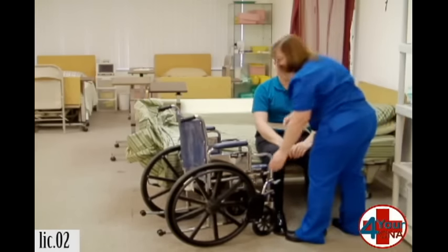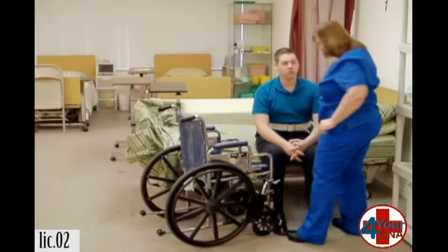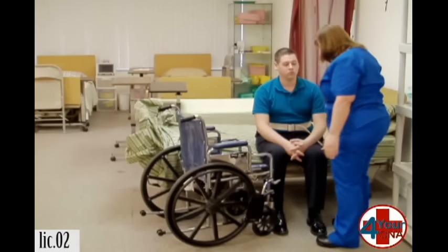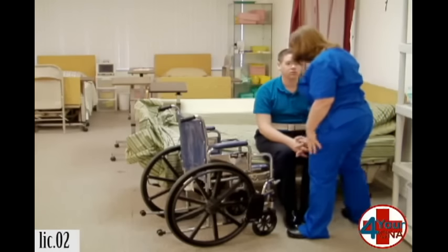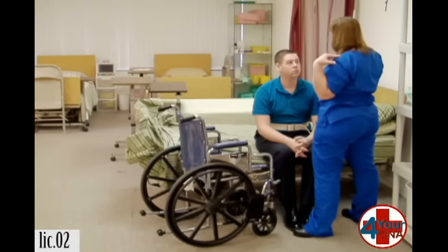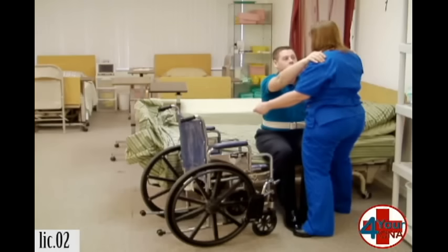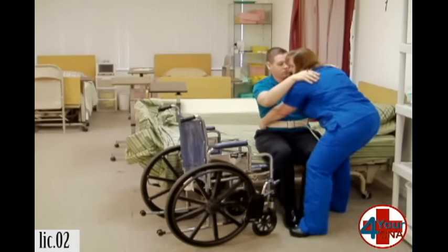I'm going to bring the wheelchair a little closer. If you can put your feet together for me. I'm going to put one foot in front to keep your legs from slipping out. On the count of three, you're going to put your hands up here. I'm going to lift you, turn, and we're going to sit down in the chair, okay? Ready? One, two, three.